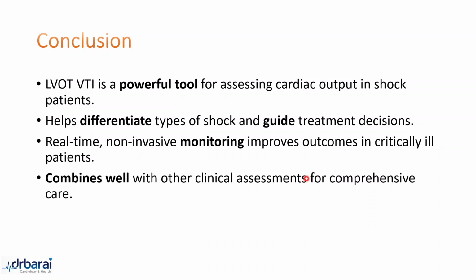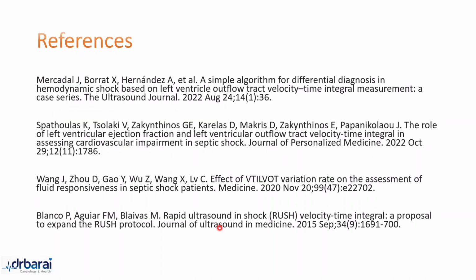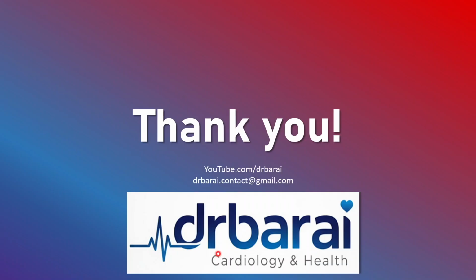Always use the LVOT VTI along with the other clinical assessments, the history, the physical examination, and the other investigations, and that will give us comprehensive care of the patients. There is a lot of work in this field. I have been working on a couple of projects, and I hope that we can get some further improvement on this topic. And if you have any questions, please drop me a line.